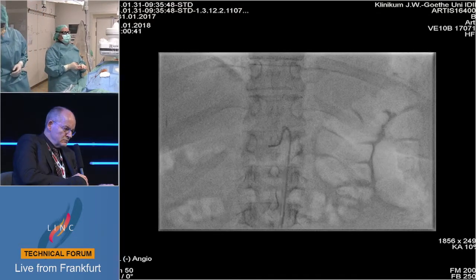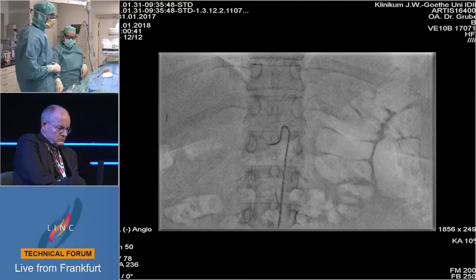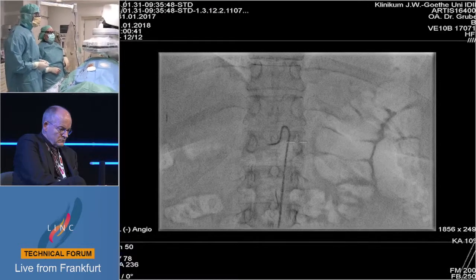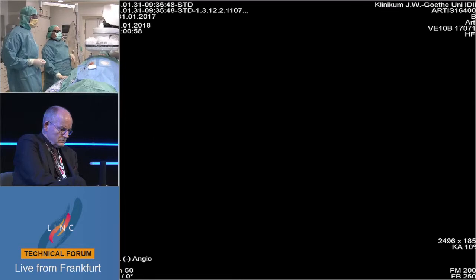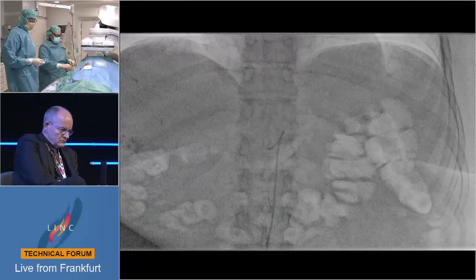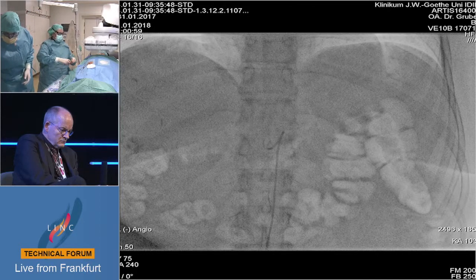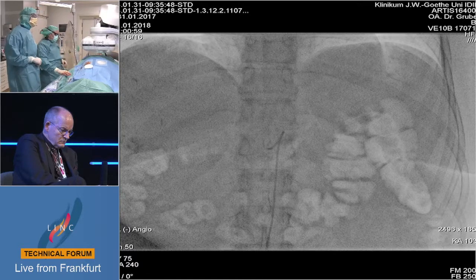It's a Progreat microcatheter 2.8F. And we have a connecting system to introduce this microcatheter through the sidewinder catheter if it is placed in a safe position. And we will now have a look at the situation. Okay, that's enough. And Dr. Gruber will give contrast agent to check the location.